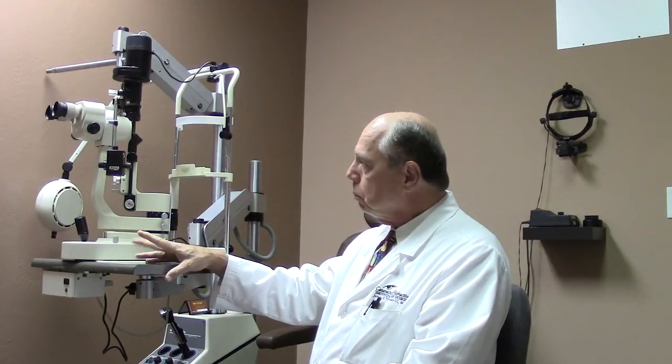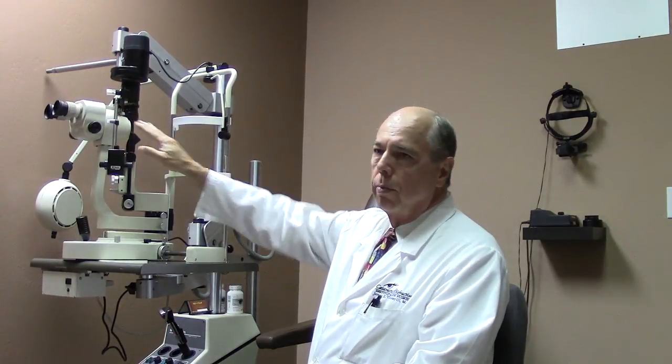The first instrument we're going to talk about is called a slit lamp. This is actually a microscope, and the microscope allows us to examine the details of your eye in a lot higher resolution, obviously because it's a microscope.